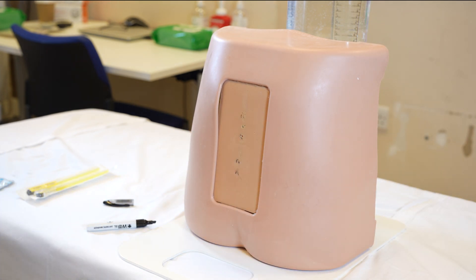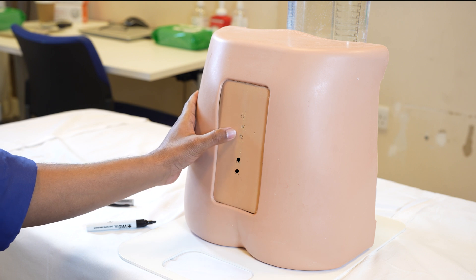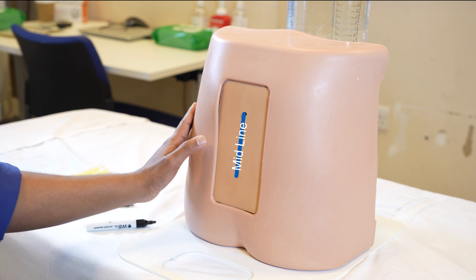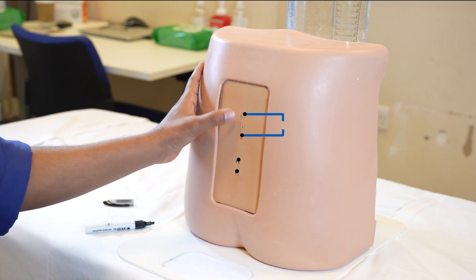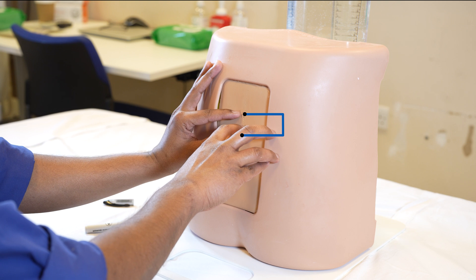So here you have four landmarks: the sacrum, the spinous process of L5, the spinous process of L4, and the spinous process of L3. Joining them together gives you the midline. We've already got early clarity into where our needle should be going. As we most commonly do, we target the L3-L4 space. So if this is the L3 spinous process and if this is the L4 spinous process, you have early clarity that your needle will be going between them.